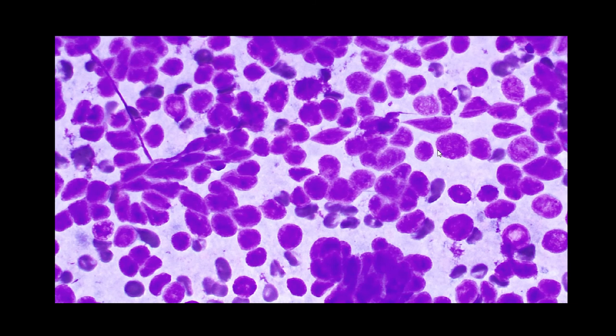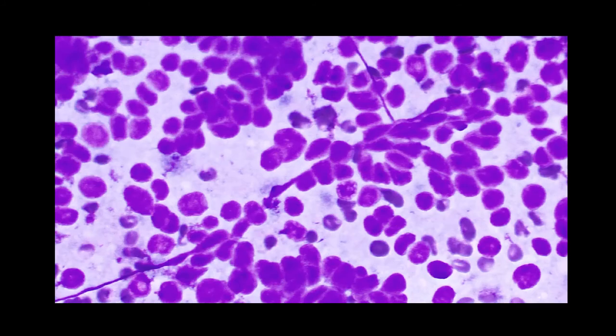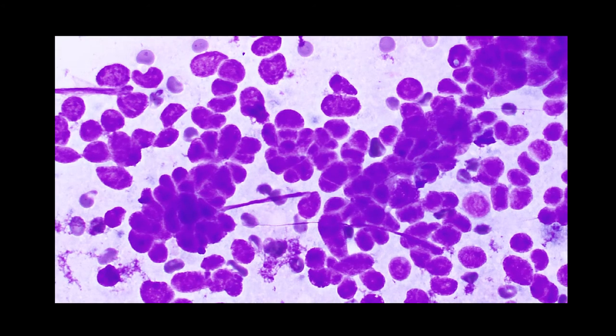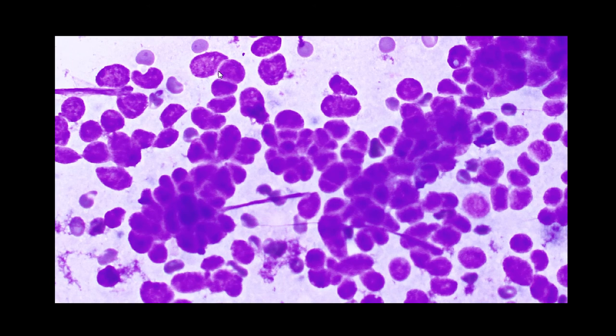Finally, a Giemsa, you can see here this elongate nuclei right next to round ones, larger oval-shaped ones, and again that moulding forming linear chains of cells, really nice chain up through there. And if you look around, they're pretty much everywhere, these vertebral columns of nuclei. Notice there's a bit of stringy material here, and that is crushed nuclei. So these are quite fragile nuclei, and often you get that crush artifact present. Now you will see that sometimes with lymphomas as well, that are also fragile.